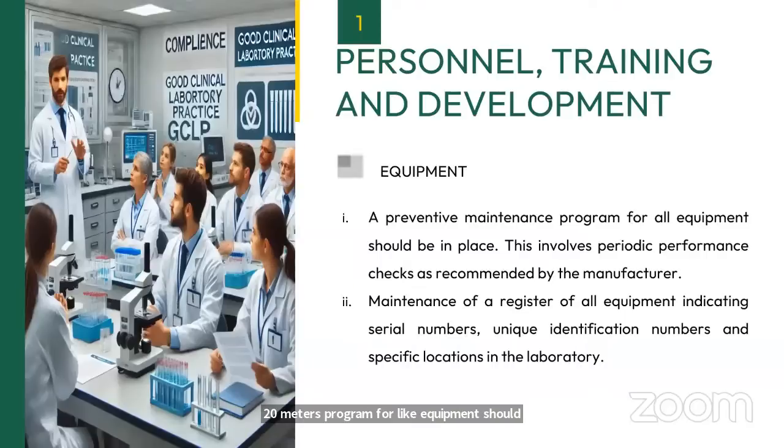This involves periodic performance check as recommended by the manufacturer. So when you are performing the maintenance of your equipment, there should be an appropriate program and you should follow the manufacturer's guidelines. If you are performing daily maintenance, weekly maintenance, monthly maintenance, it should be as per the recommendations provided by the manufacturer.